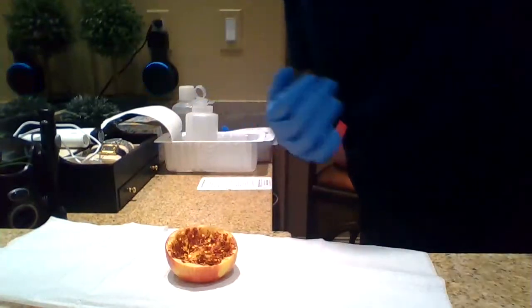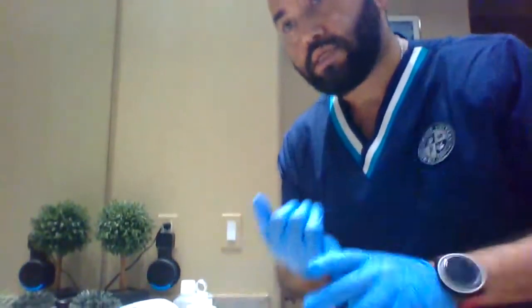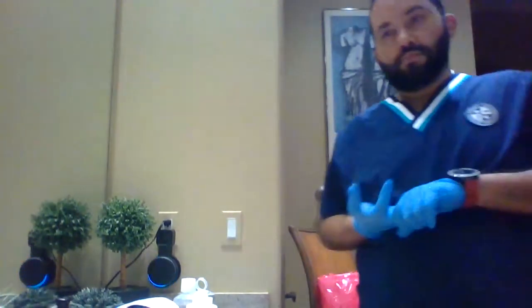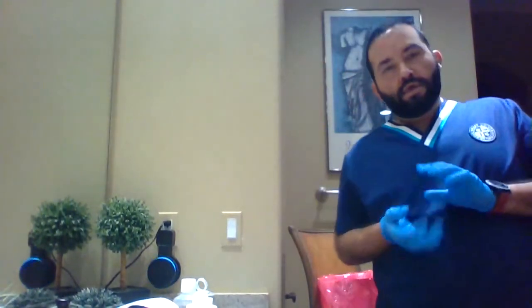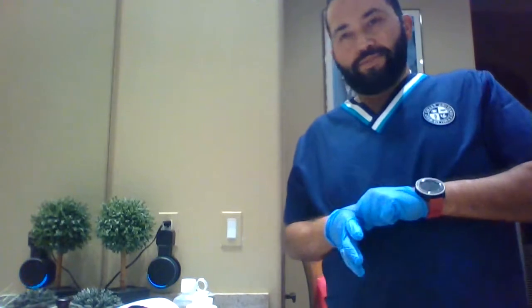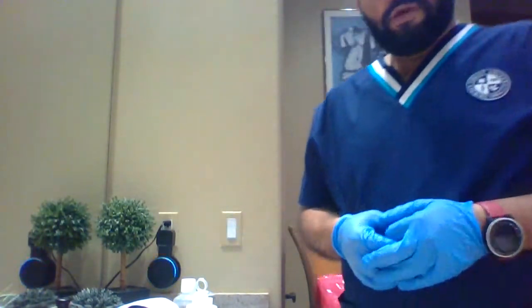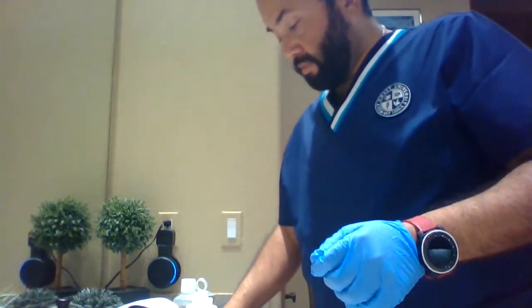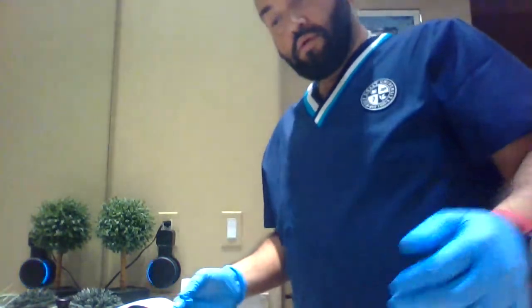We're looking for granulated tissue, exudate, eschar, slough, edema, infection. We're looking for any of that. So what we do here, now we have to measure.